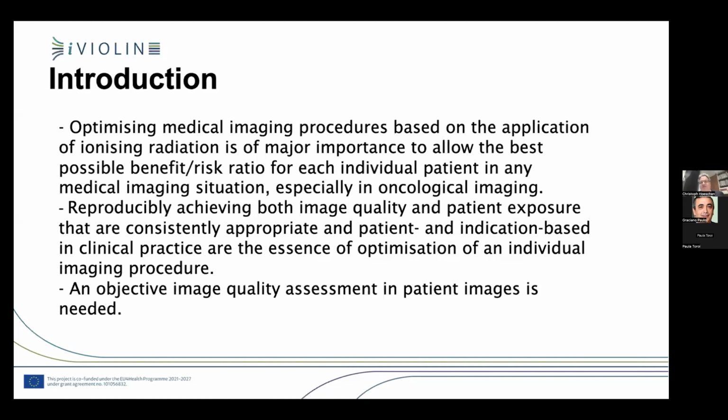As Paula also mentioned, there are people who will have more imaging procedures than typically for a standard evaluation outside the oncological world. We also need reproducibility in achieving both image quality and patient exposure that are consistently appropriate, and patient and indication based in clinical practice.